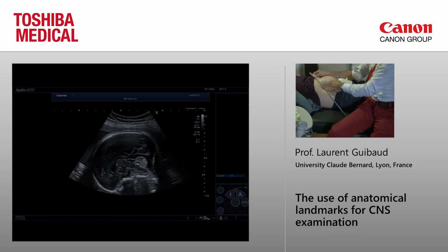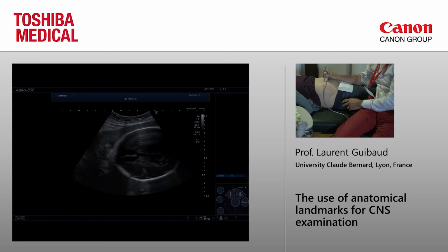You see the chiasma. You see the brainstem. Okay, and you see the aqueduct just above the vermis. Okay. Another question?